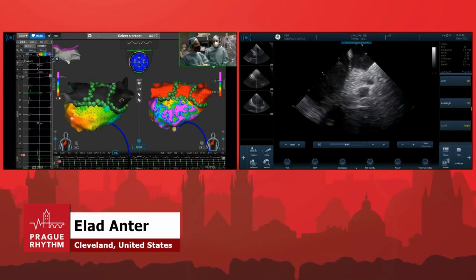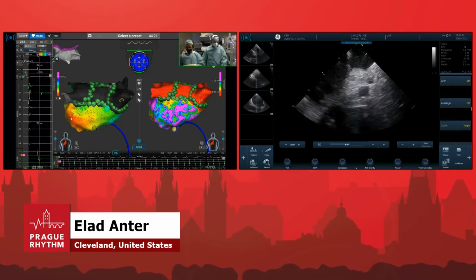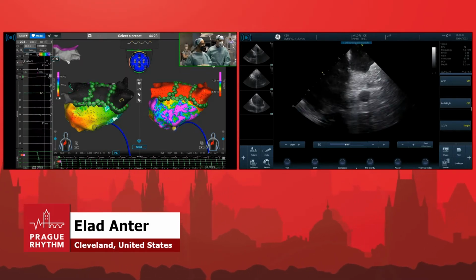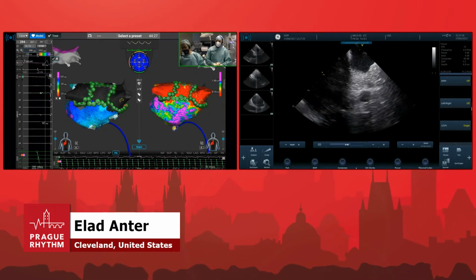We converted the patient to sinus rhythm as he was in atrial fibrillation, did the activation map, and then did a sequence of pacing to induce an arrhythmia, and we did induce this tachycardia. Maybe you can switch to Pruka?